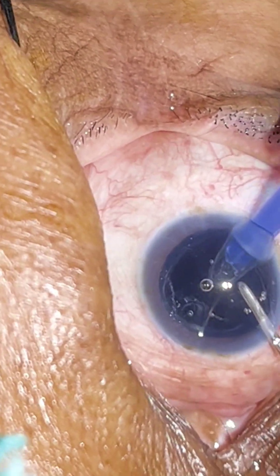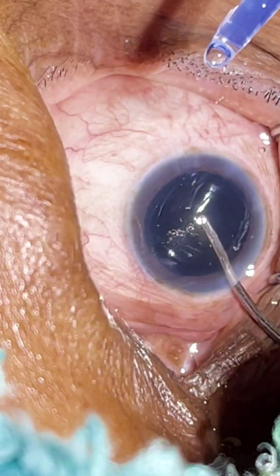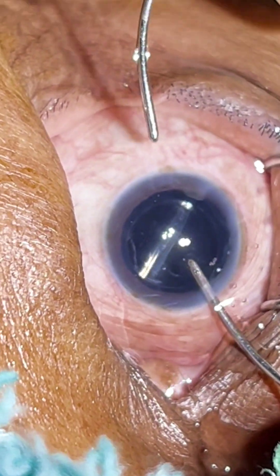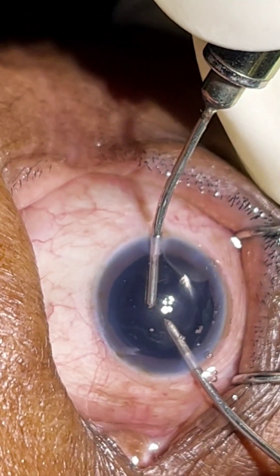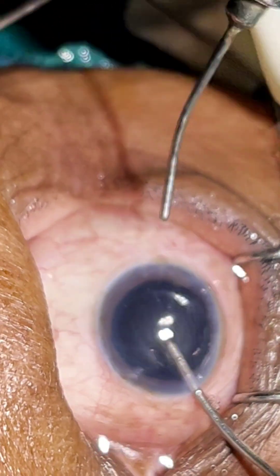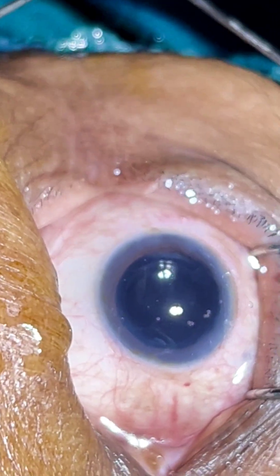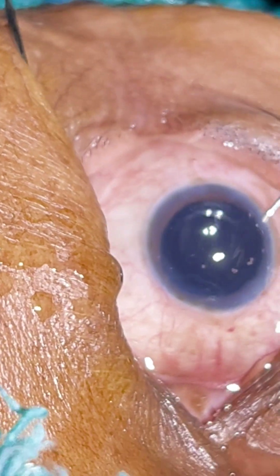Now putting the IOL. If it is loaded properly and injected properly, we don't have to dial it — it nicely slips into the capsular bag. You see how nicely the IOL got implanted inside the capsular bag. So this completes the phacoemulsification cataract surgery.